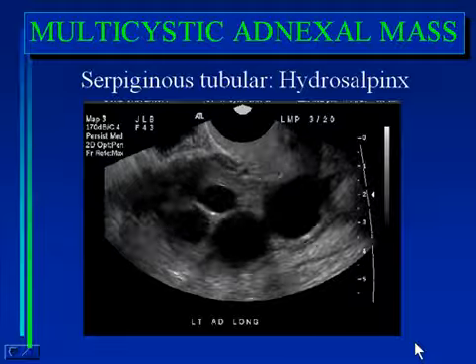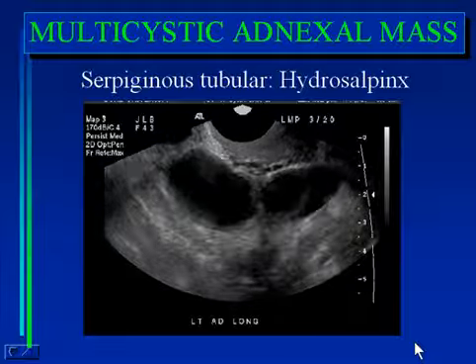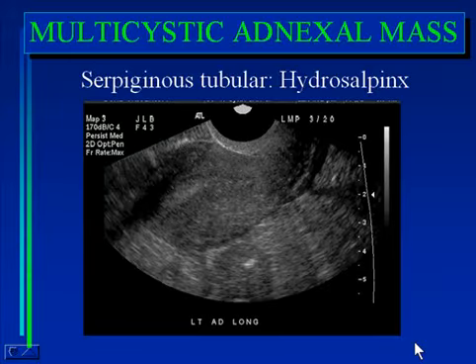However, when one looks at this at real-time evaluation, you can see that the components of the mass are tubular and connect up, and this was not a multicystic ovarian mass, but rather was a dilated hydrosalpinx.